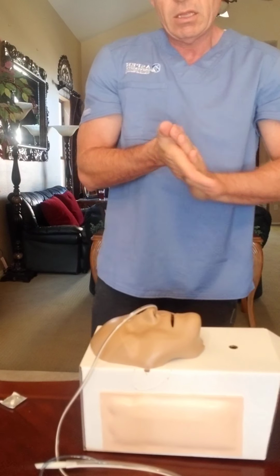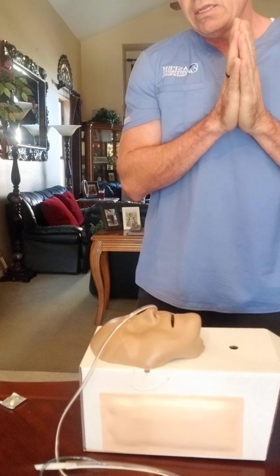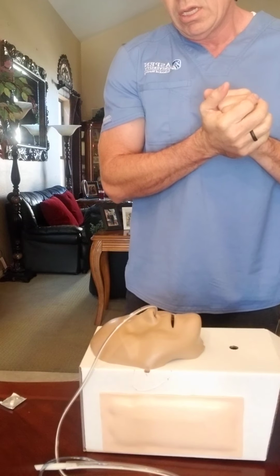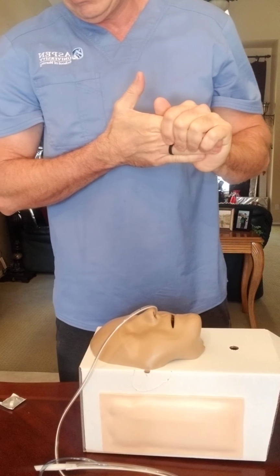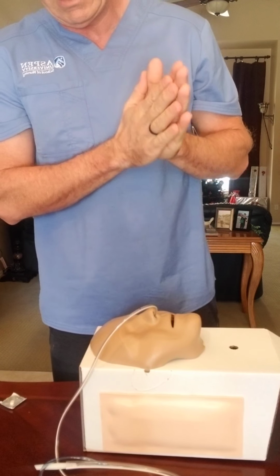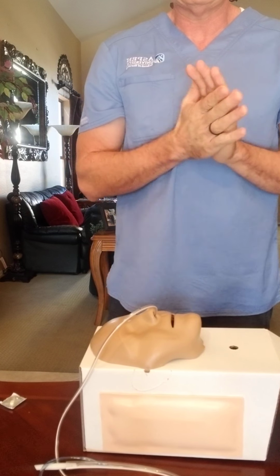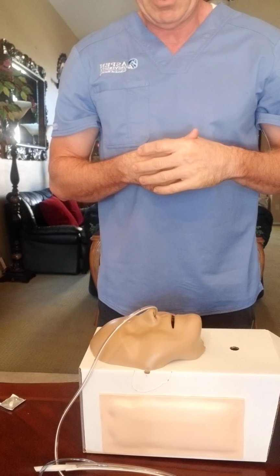I'm gonna leave the patient at a high Fowler's position so that from all the liquid that I put in through his NG tube, there's no room for aspiration. I'll come back and check on him in about 35 to 40 minutes. The idea is to have him sitting up for about an hour, so there's no room for aspiration.